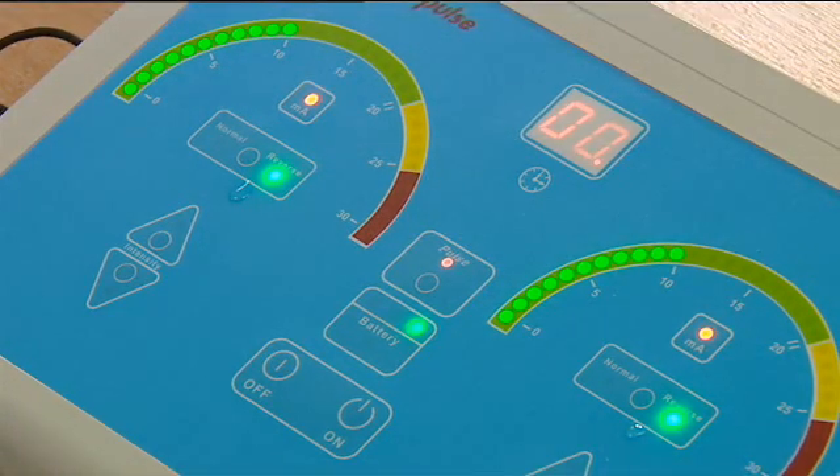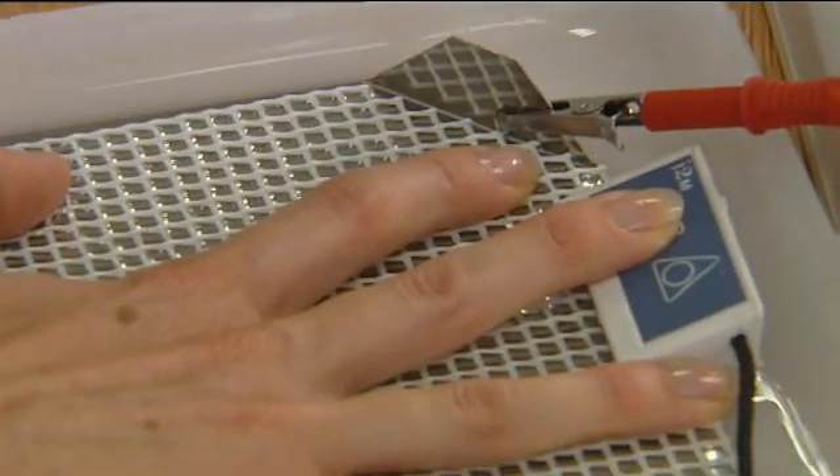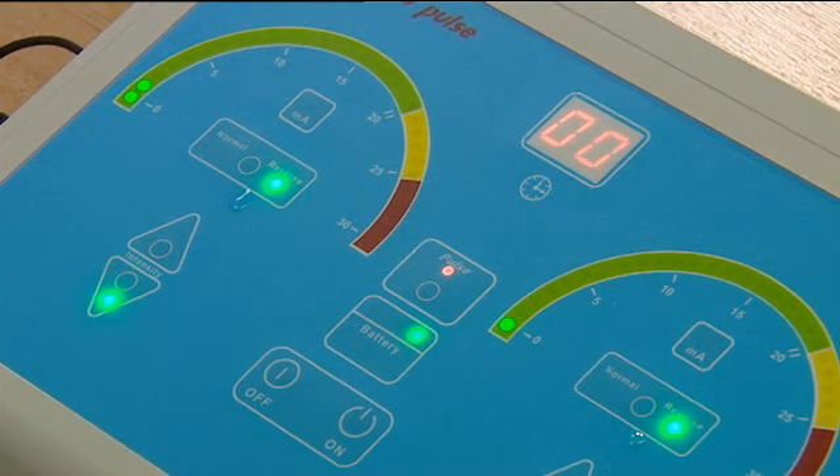Pulsed current is ideal for those with sensitive skins and we recommend it is always used when treating the axilla. In pulsed current mode, the perception of the current flow is less for the user, which therefore allows higher treatment currents for sensitive people with equivalent therapeutic results. Treatment may begin with hands only, feet only, axilla only, or hands and feet together.